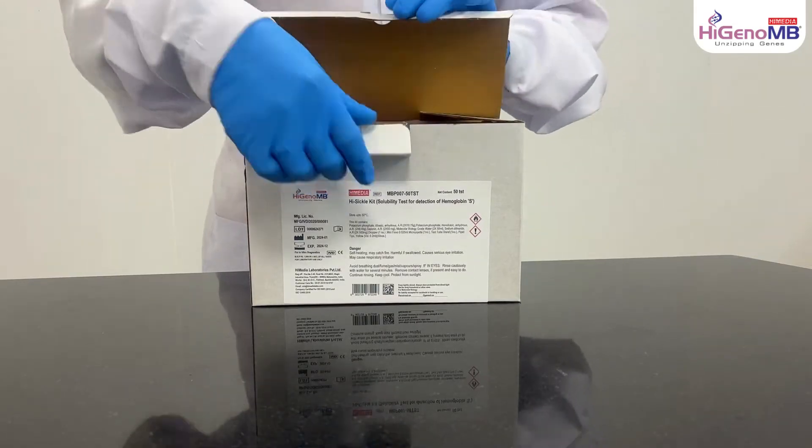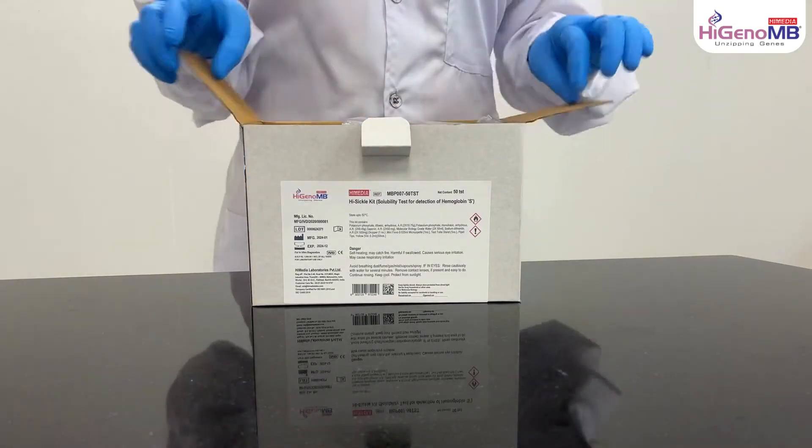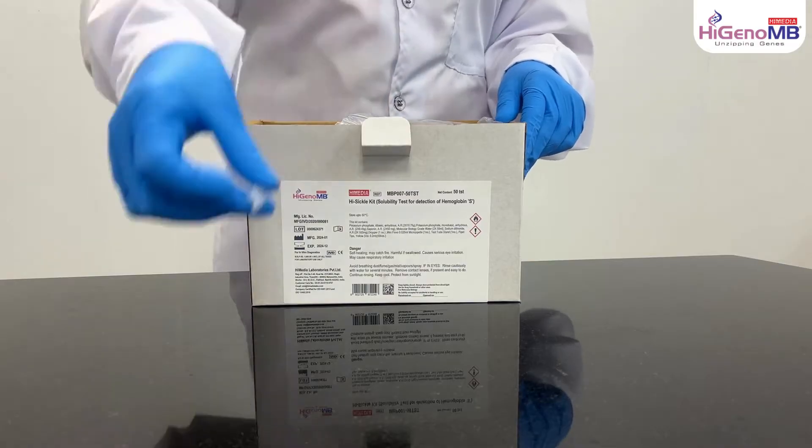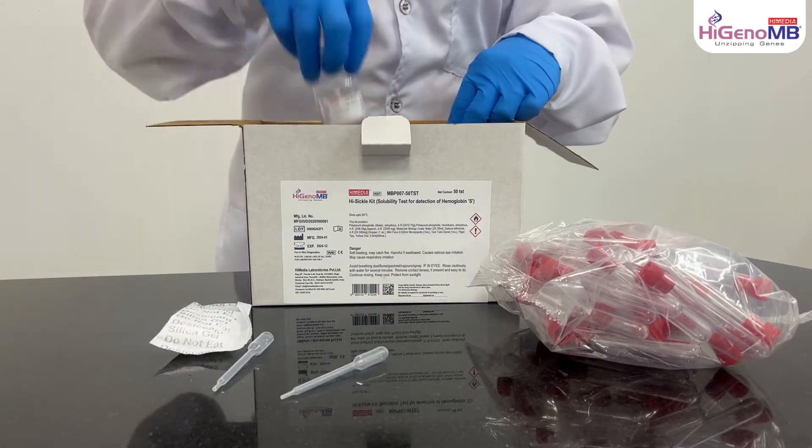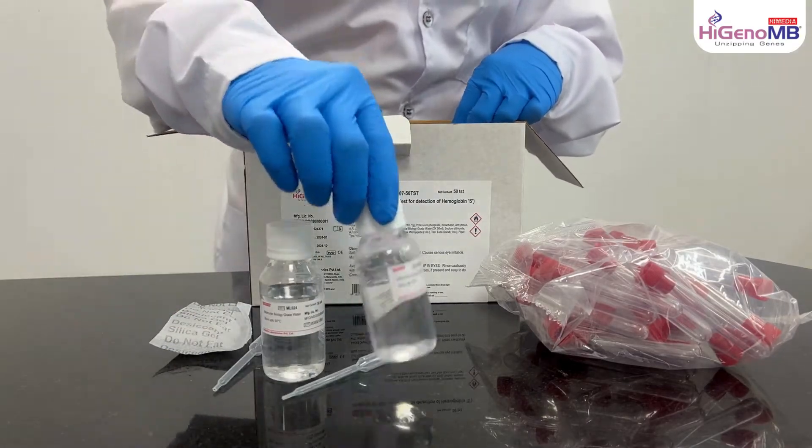For using MBP007 High Sickle Kit, first take out all the ingredients from the box.